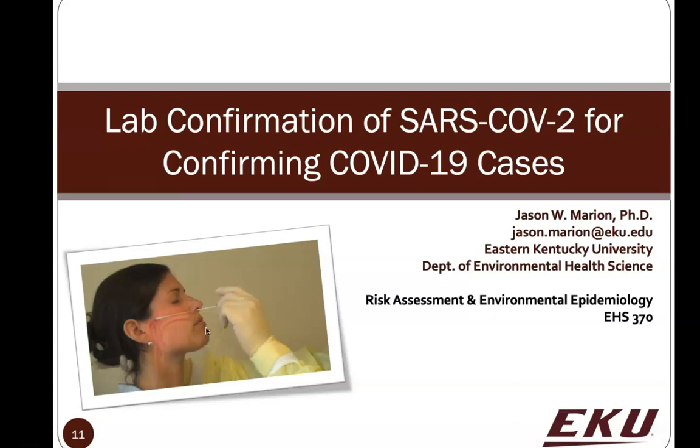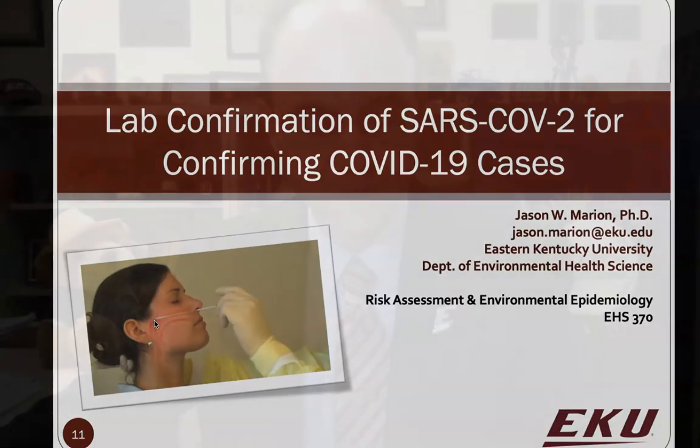That nasopharyngeal swab that you see there is going all the way to the back of the nasal cavity where it meets the pharynx. And this is the most sensitive method that we've got for actually detecting the presence or absence of the actual SARS coronavirus 2. There are other places in the body where they have been able to actually identify the virus. Mucus, sputum from the deep lung, even saliva, and also even feces. So the stool samples have actually had some SARS coronavirus in some cases, at least based off of what we know from the Chinese data.